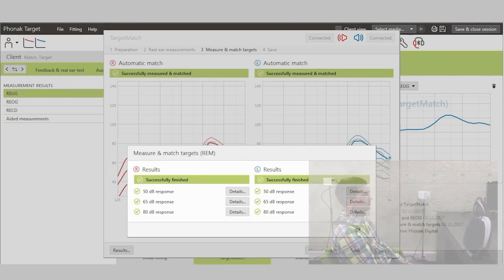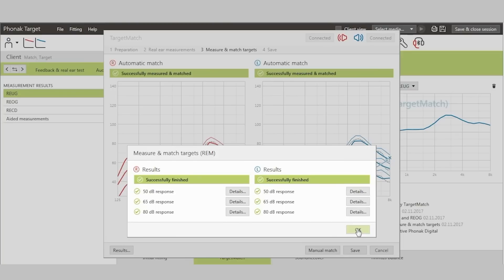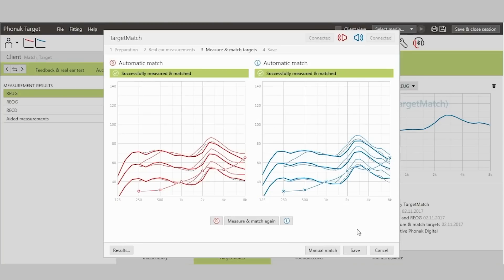Once measurements are complete, details are provided for review. The dashed gray lines are the individual targets based upon the client's ears. The thin solid lines are the pre-calculated target from the respective algorithm used. The thick solid lines are the aided responses of the hearing aids.